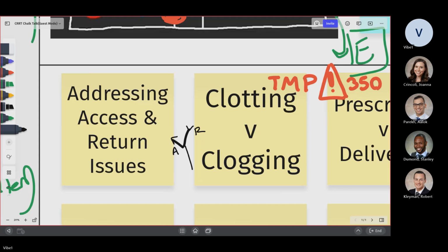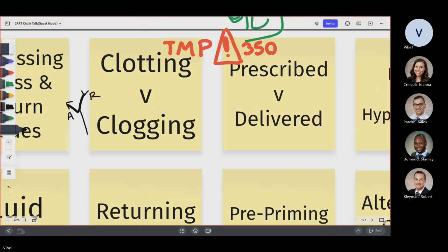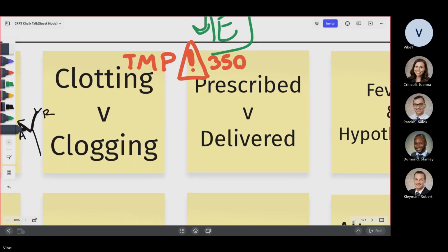One other thing for you guys to remember is that when you're running CRRT on patients, the adequacy of the treatment is very important. If you're running CRRT, you don't want to disconnect: "Now I want to send the patient for a CAT scan. Now I want to send the patient for ultrasound. Now he has to go for this." It's better to plan whatever needs to be done, because once you disconnect the machine, you can prime it and keep running it for 3 hours only. Once it's more than 3 hours, you have to discard the cartridge and use a new cartridge.